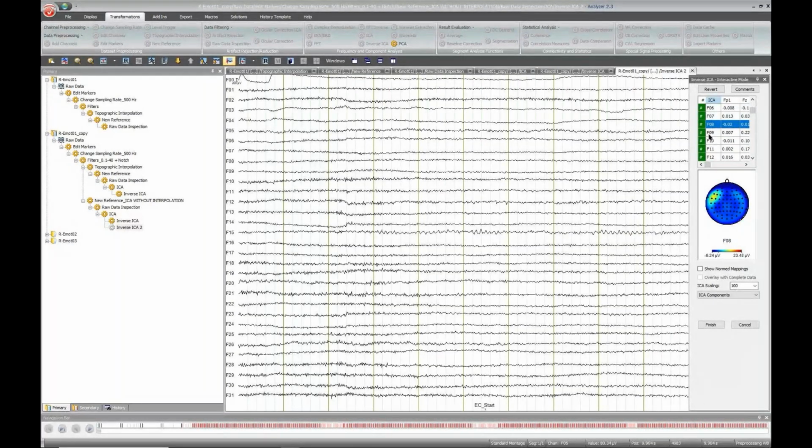So this causes it to occupy space from many components as they go through trying to separate the patterns in the data. And the effect that this can have is that since they are occupying many components, then the decomposition of other components may be less precise.